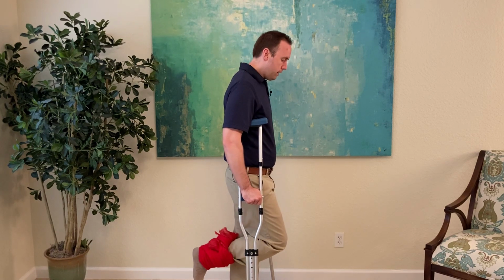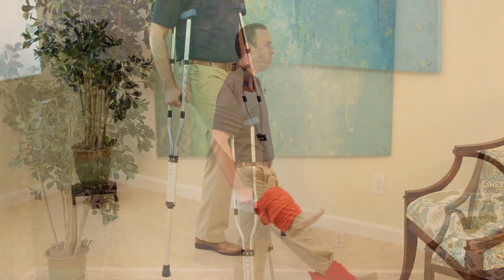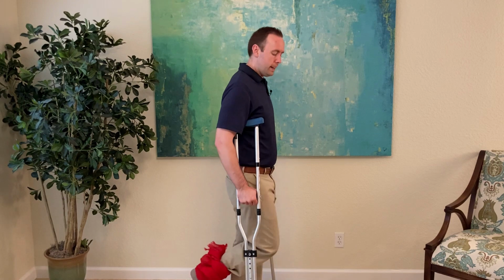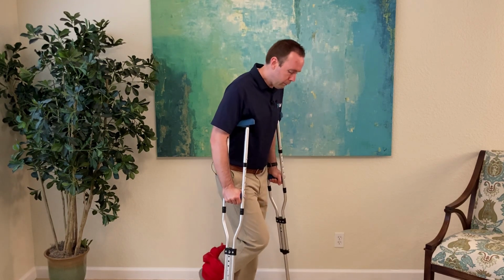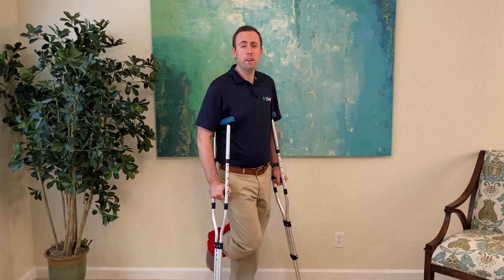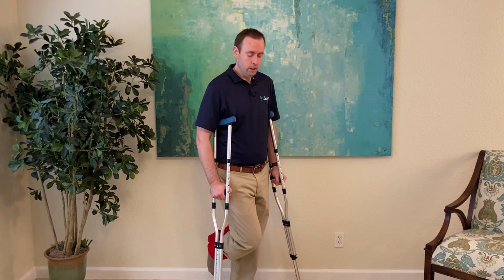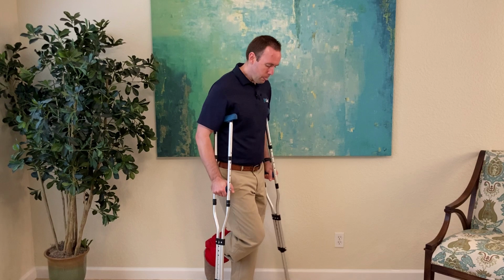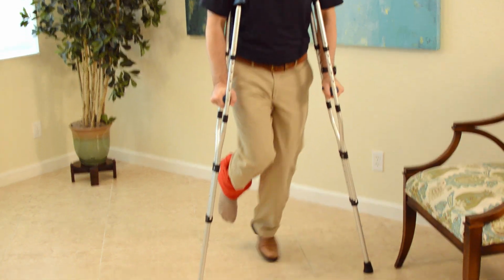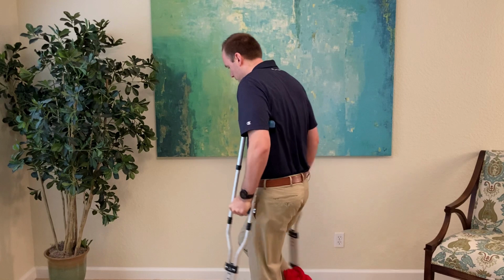I've got that leg kicked out, and what that does is it helps your hip get a little bit of relief. Because if you're holding it straight out like this the whole time, that's a lot of leverage being placed on your hip. That hurts. That doesn't feel good. So if you keep your foot bent a little bit, your knee bent, it's going to feel so much better on your hip, and you're not going to tire out, which is important because you only have one leg to work with. So again, you're going to go like this: crutches down, left leg or strong leg. Crutches, boom. Crutches, boom. Crutches, boom.